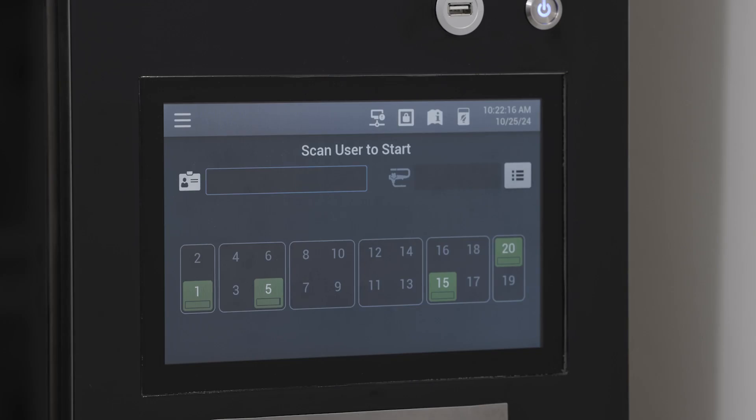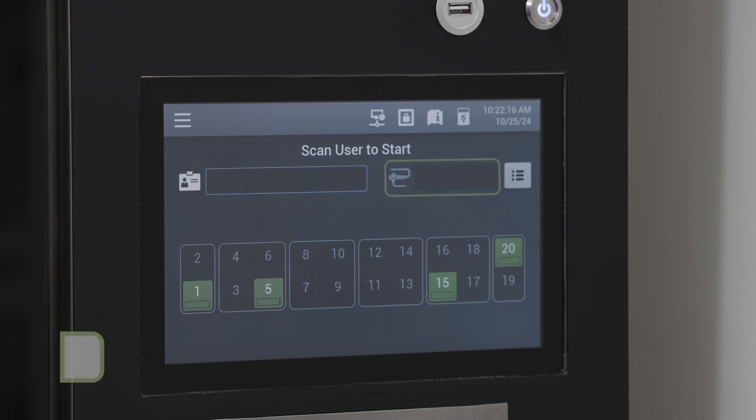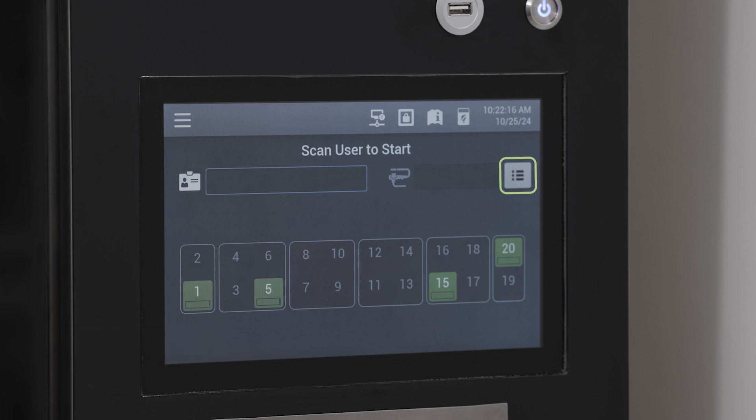The user interface displays the following information. The user ID text box is required to be able to operate the cabinet. Users can enter their unique ID via the barcode scanner or using the virtual keyboard. The endoscope ID text box allows the user to enter an endoscope ID. With the view layout options, users can toggle between the tile and list views. In list view, the user can sort endoscopes by hanger, type, and status.